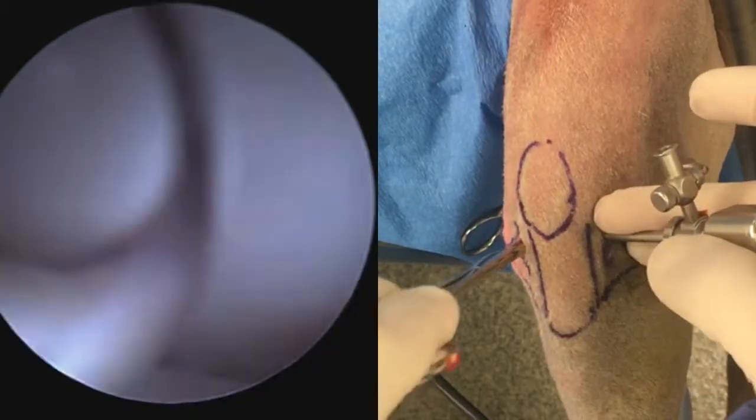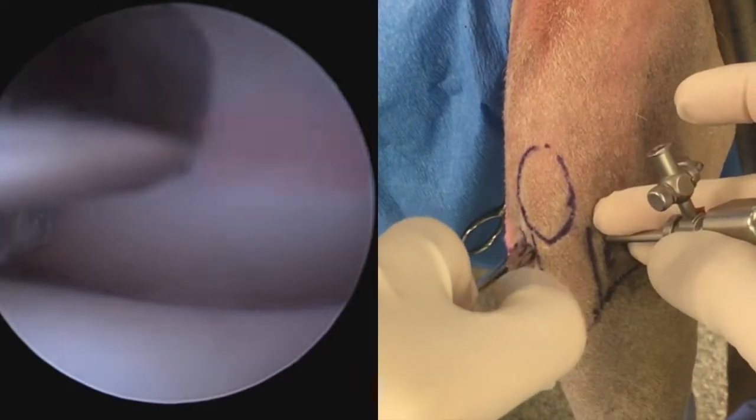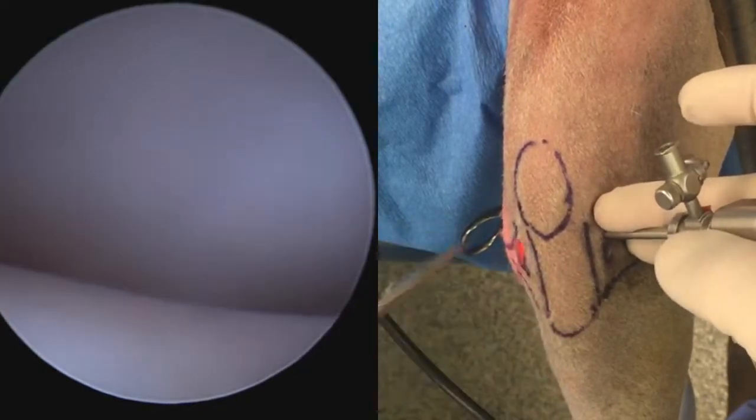The instrument port should be quite wide, because in this technique a separate egress channel is not being used, and so fluid will egress out of this instrument port.